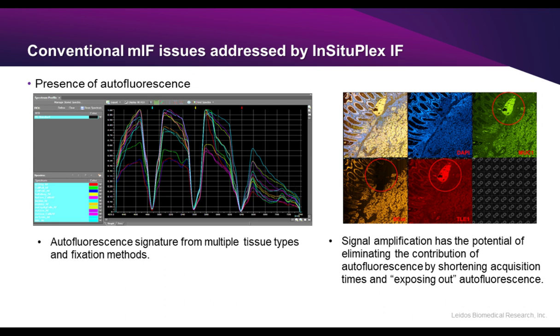Once you've actually stained with eosin and hematoxylin, you really won't be able to go back to your fluorescent aspect of the tissue and re-image it. So it's really important that you capture your fluorescent image the way you want it before you actually start the H&E process.